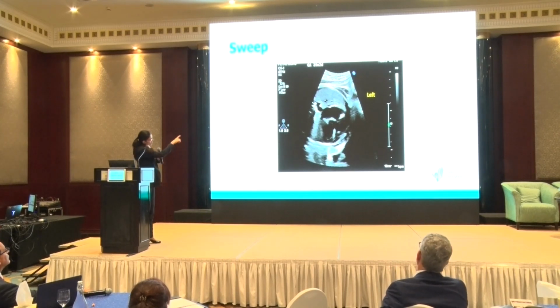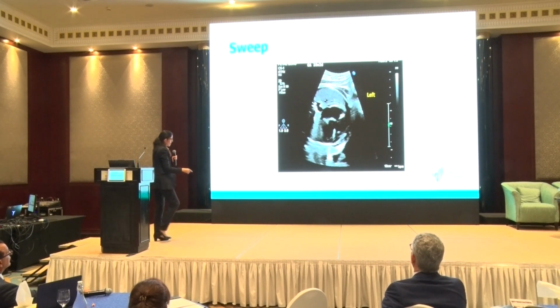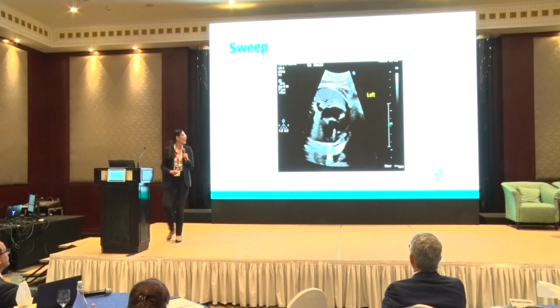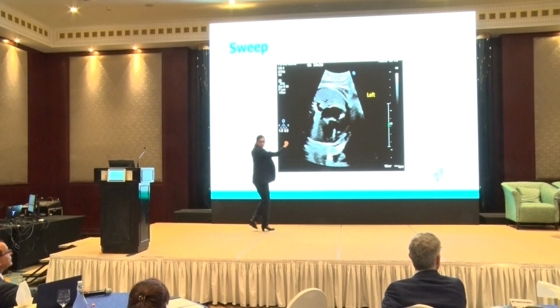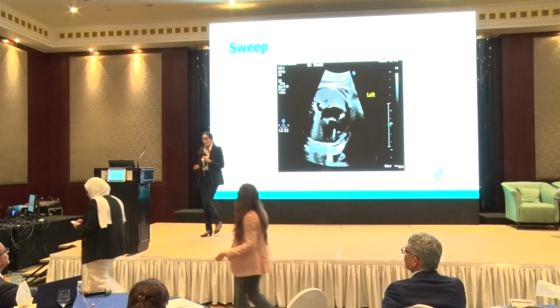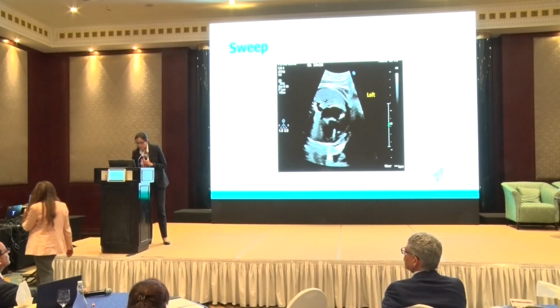And then when we look at the four chamber view, this side, this ventricle, is the one with the moderator band. So this one is smooth, this one has a moderator band. So we have on the left side, the right ventricle, and on the right side, the morphological left ventricle. Yeah, I will run it so Dr. Suleiman can agree. Okay, and then we have this big defect, kind of an inlet ventricular septal defect. Okay, so that's from our four chamber. Now we're sweeping up.